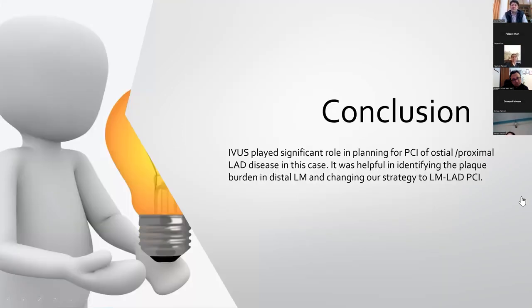IVUS played a significant role in planning for PCI of ostioproximal LAD in this case. It was helpful in identifying the plaque burden in the distal left main and changing our strategy to left main to LAD PCI.